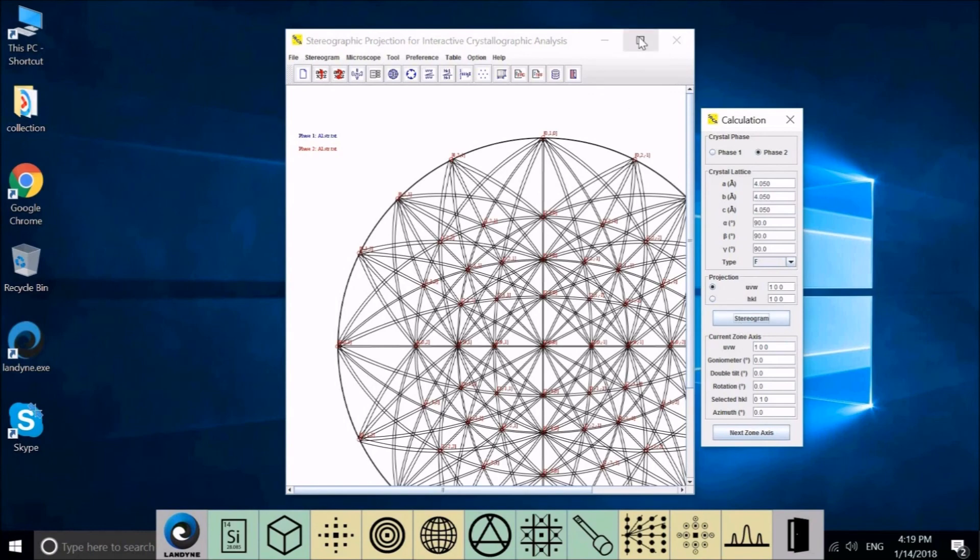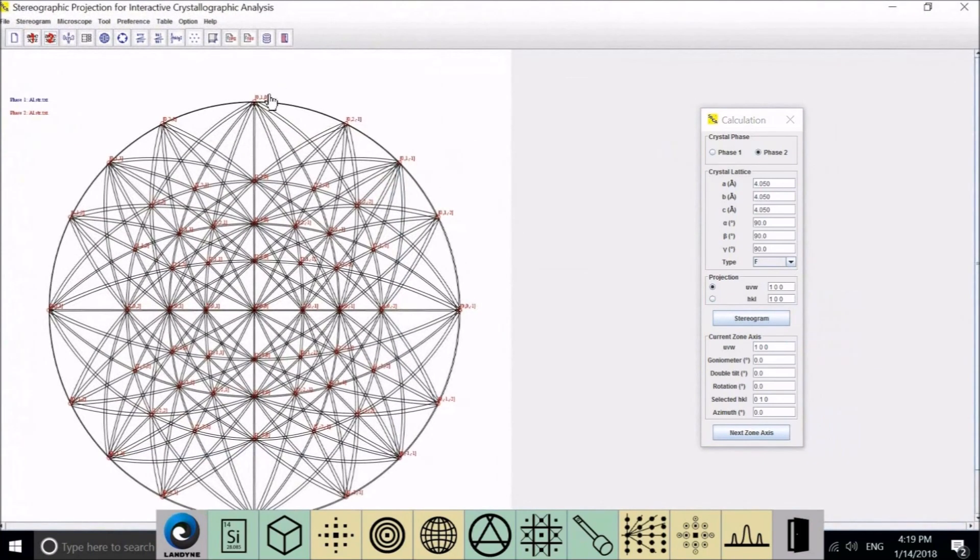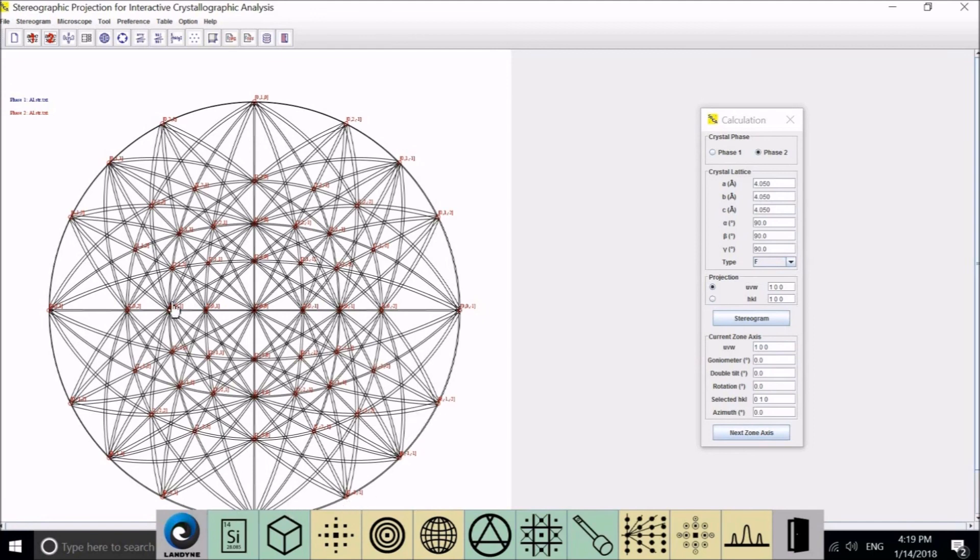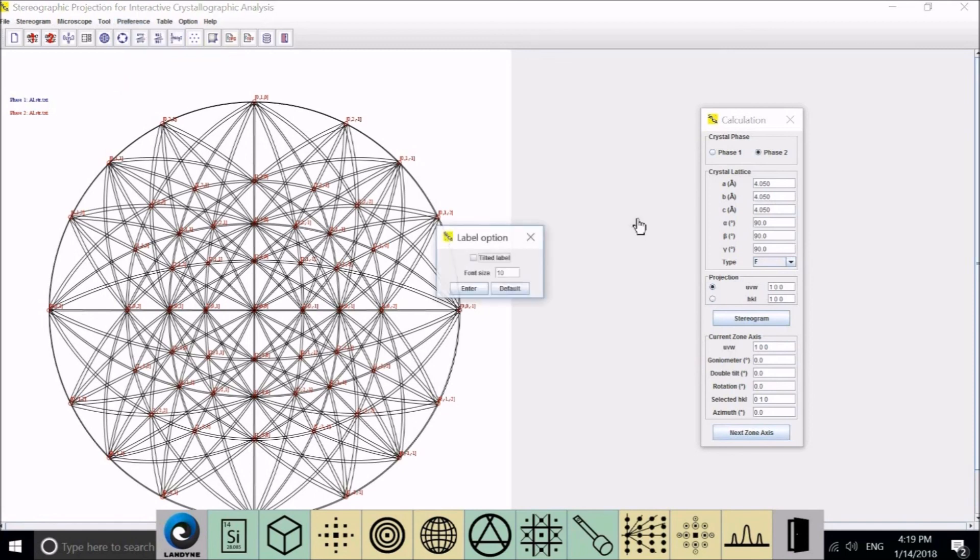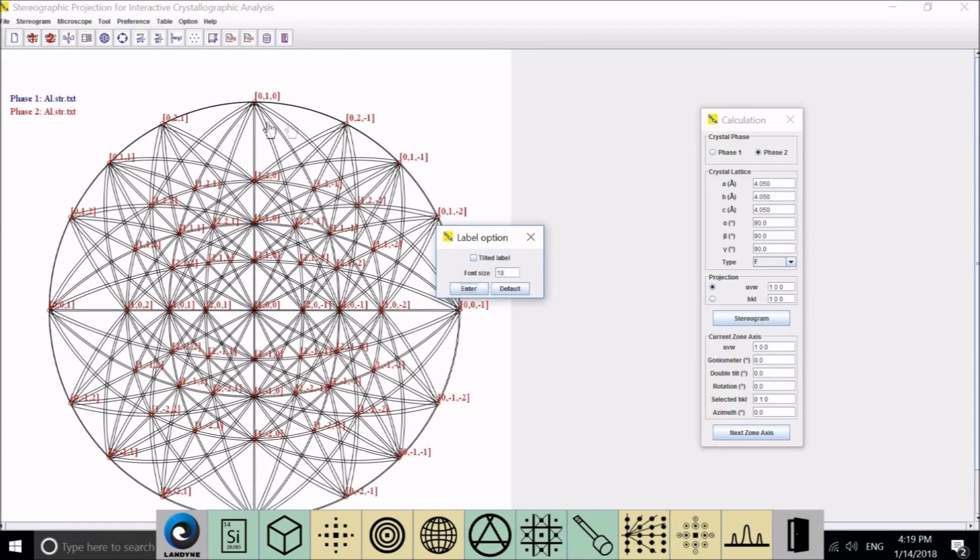Those with high index numbers, if you want to increase the index to higher, we can go to Preference and increase the label size. This is 10. We can change it to 18. So all the numbers can be seen clearly here. And you can generate Kikuchi maps for other zone axes like 1, 1, 1.